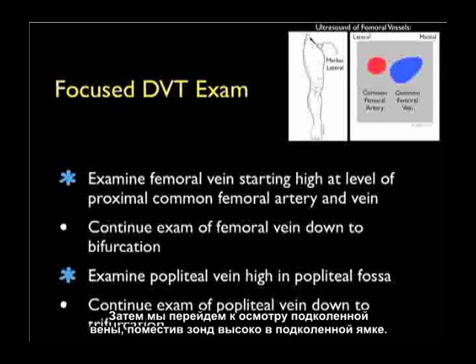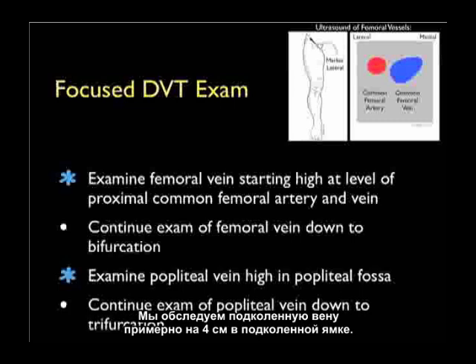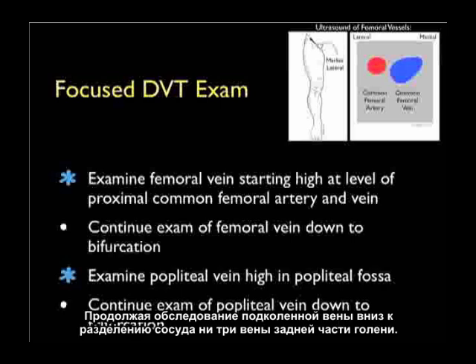We'll then turn to examination of the popliteal vein, placing the probe high within the popliteal fossa. We'll examine the popliteal vein about four centimeters within the popliteal fossa, continuing the exam down to trifurcation of the vessel into the calf veins.